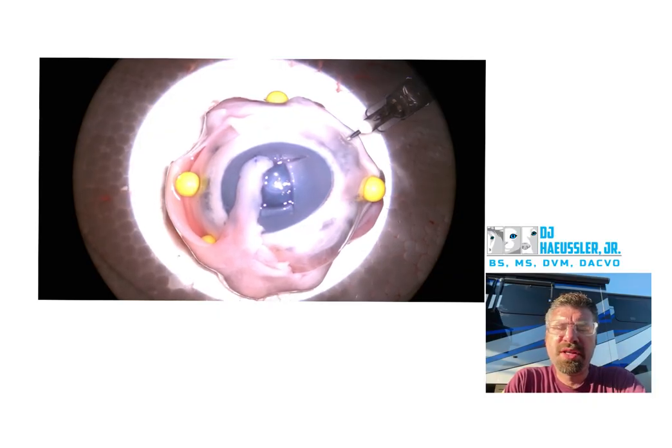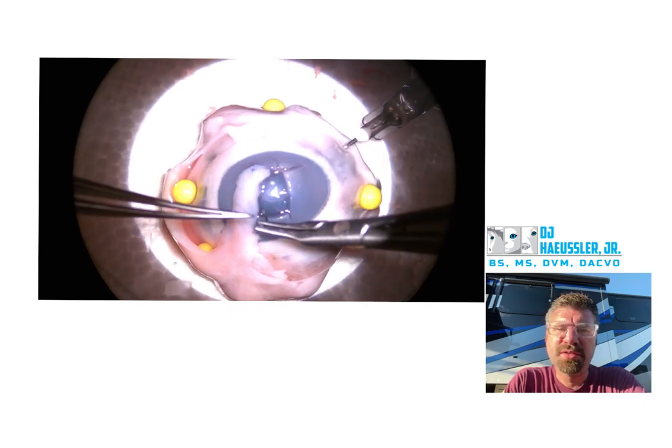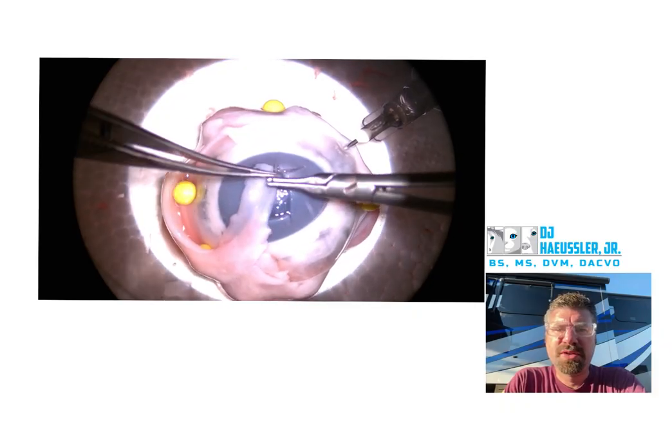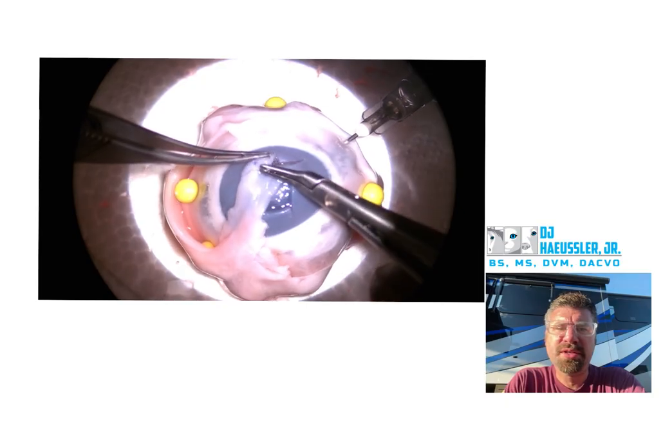You can see here how your two cardinal sutures are essentially not functional. Looks like you cut one out. Try to get that right from the first get-go — you're losing time now by doing this.